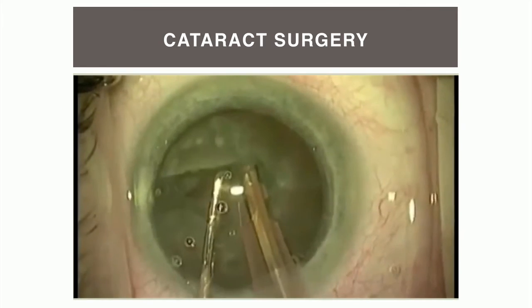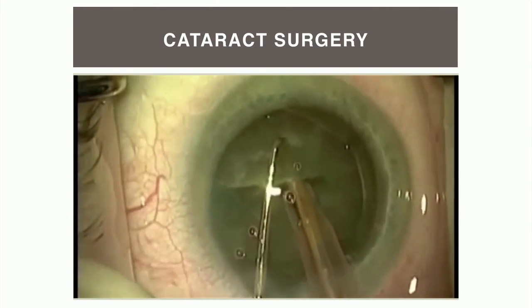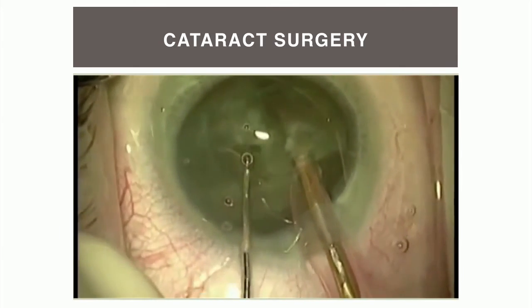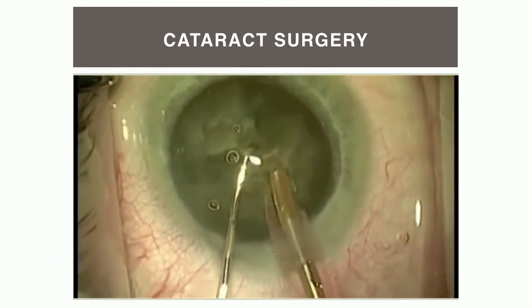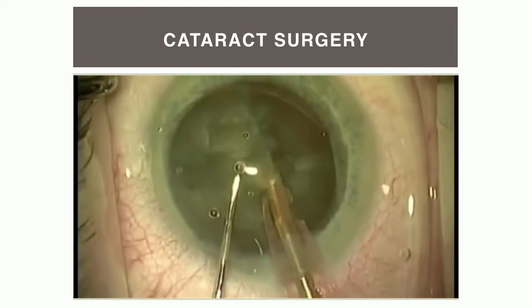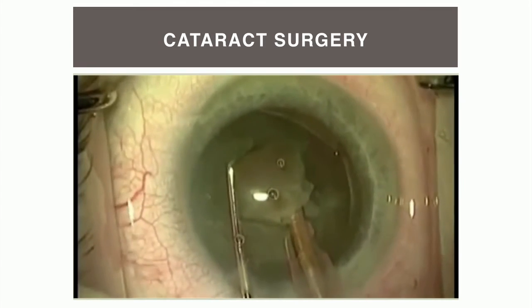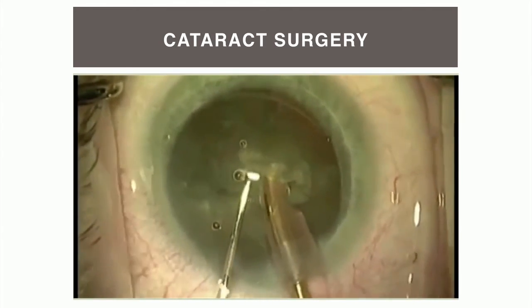And then he's going to rotate it around so he can access it more easily with his ultrasound probe, which is going to further break up the cataract into little digestible bits. So essentially what you're doing is you're using ultrasound and some physical manipulation to break up the cataract into multiple pieces and vacuum the cataract out of the eye.